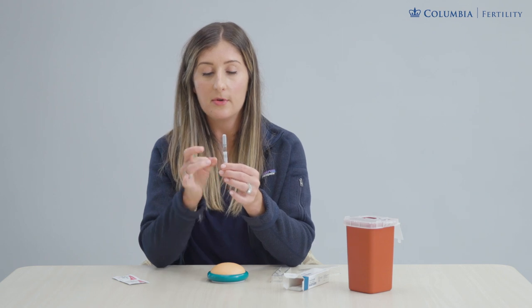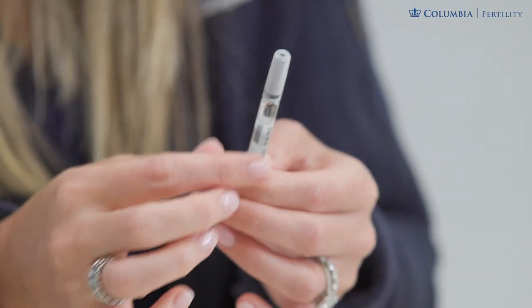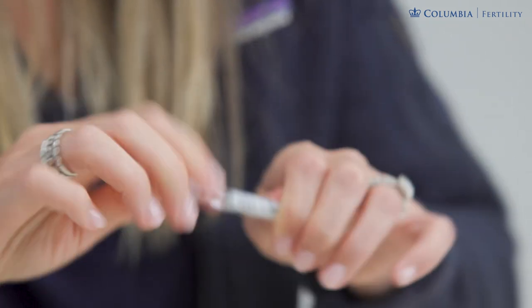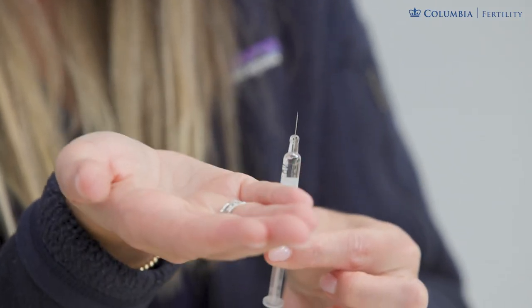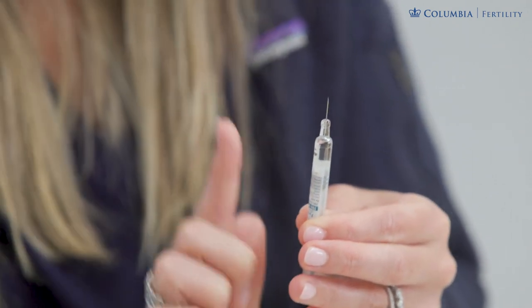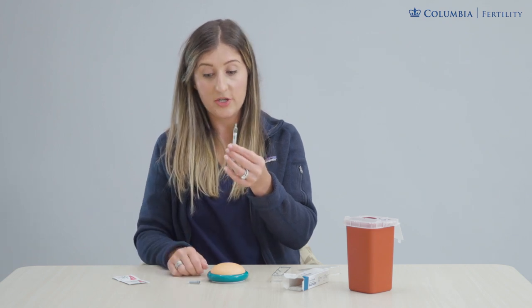So if there's an air bubble in here and you flick it, it's going to rise to the top. If you don't see a bubble you can skip this step, but if you see a bubble we can uncap the syringe and just push up on the plunger, which will squish out that air bubble to the top making it either very small or disappear. I don't need to see medicine squirting out of the needle, just make it smaller and then it's ready to inject.